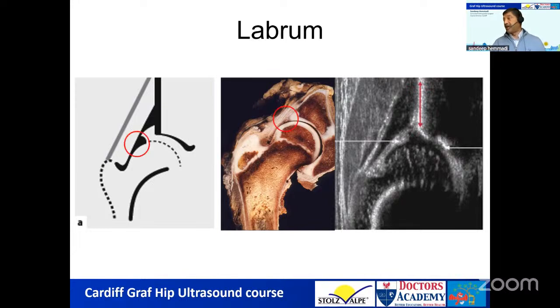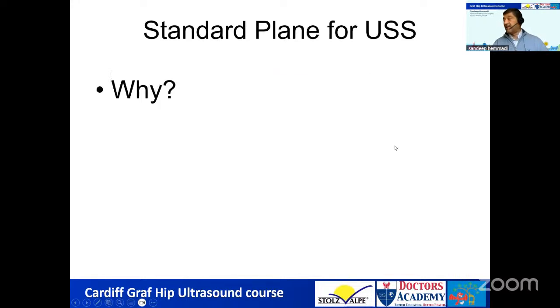So that's the labrum there, which you saw in anatomy. And so on the line drawing, my labrum is here. In the histology specimen, it's this little triangle here, and on the ultrasound, it's this bright spot there.